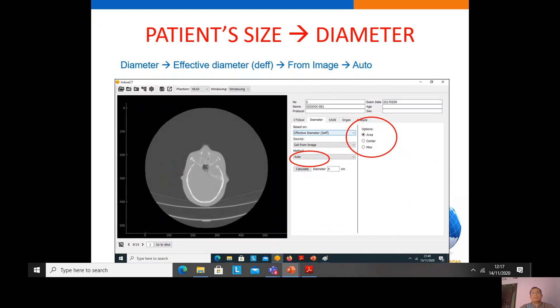The software also provides an automatic technique to measure the effective diameter from the image. Choosing auto gives three options for automatic calculation of effective diameter: based on the area of the patient image, from the center of the patient position, and from the maximum AP and lateral diameter. If we choose center, the software detects the center of the patient image and calculates the diameter in the AP and lateral directions, then automatically calculates the effective diameter.